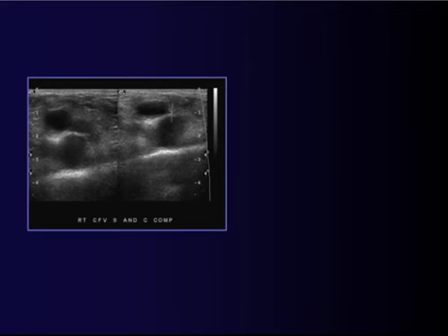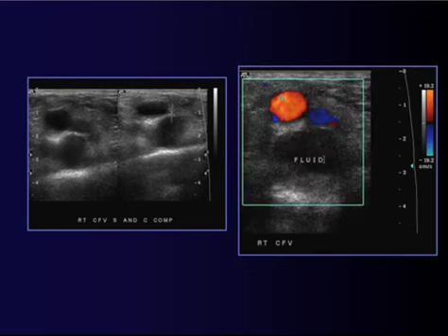One other thing commonly presenting in patients with groin pain who come to our department to evaluate for common femoral vein thrombosis is iliopsoas bursitis. And here we can see a compression view. We have the artery and the vein completely collapsed, but there is an extra structure, which is actually a fluid collection. And you can see again here, we have the artery and the vein, and then we have a fluid collection deep to the common femoral vessels.